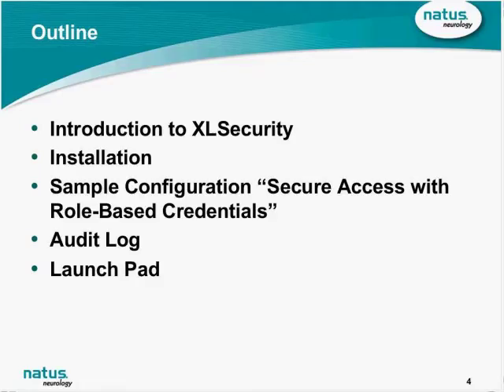So I want to start off by providing you with an outline of the topics I'll be covering today. First off, I'll be providing you with a little introduction to XLSecurity. Then we'll talk about installation of XLSecurity. We'll then review a sample configuration, otherwise known as secure access with role-based credentials. This will make more sense as we move along in the presentation. I'll talk to you about an audit log, which is basically a transaction record indicating the activities that took place on a particular machine. And then I will also talk about the Launchpad, which is another component of XLSecurity.